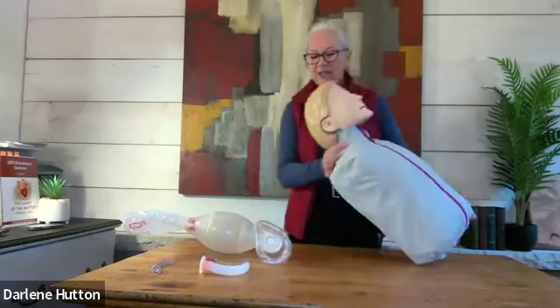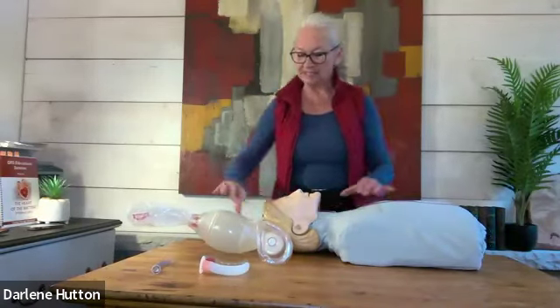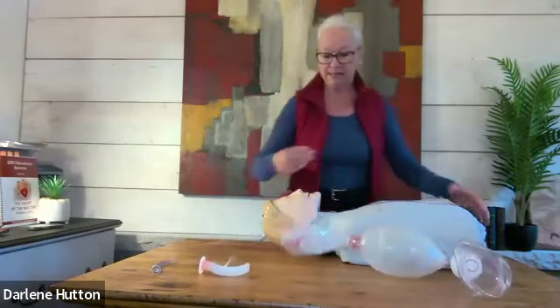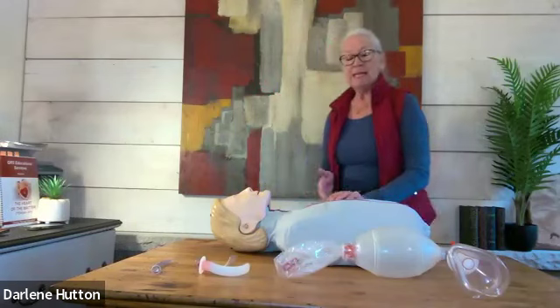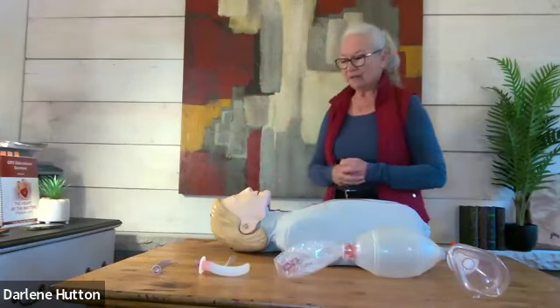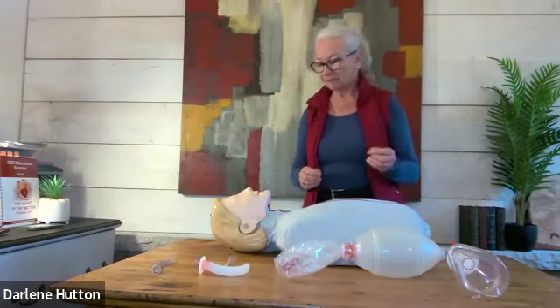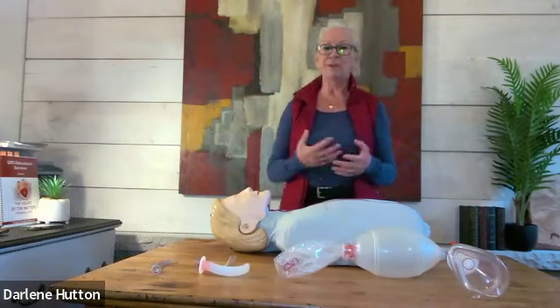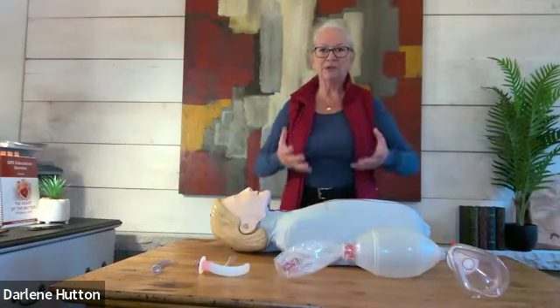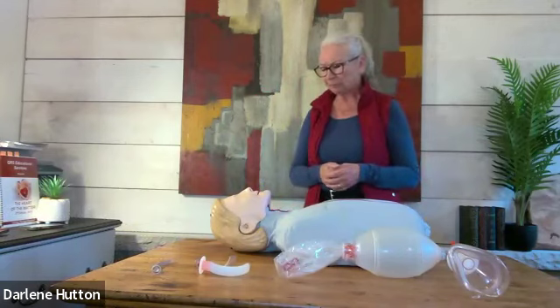The first section we will be looking at is basic airway management. So let's start at the very beginning by seeing this unresponsive patient. First thing we need to do is our scene survey, and we need to ensure that the patient is unresponsive. In a hospital environment, we will have our personal protection equipment on, so assume that that's what you see on me as I present.